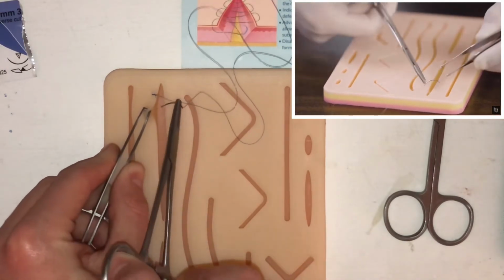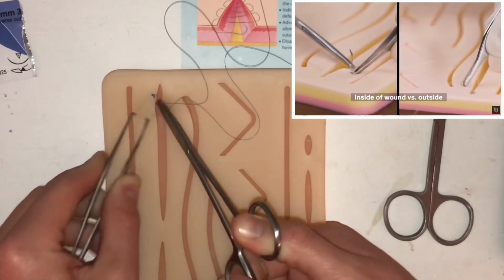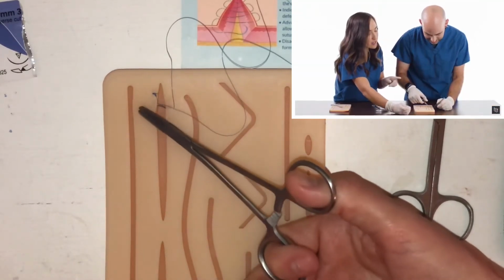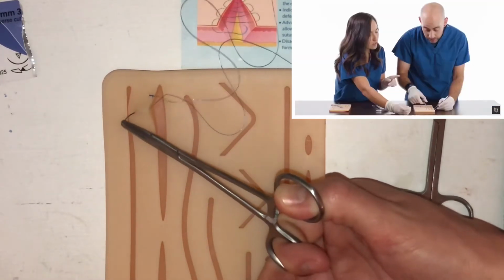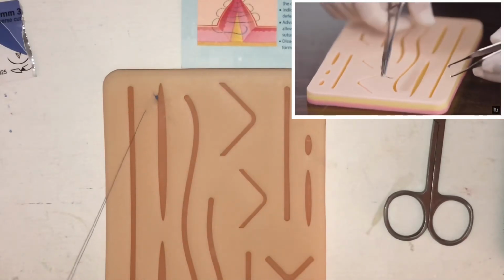Yeah. And in real subcuticular tissue, you want to come out inside the wound so that the stitch gets hidden, but that's okay. For our purposes, that's your first bite, that's fine. The point of this closure is that you don't see any suture. So am I going across or am I going along? No, now you're going across. Now I'm going across. But again, use your pickups to show yourself where you want to go.